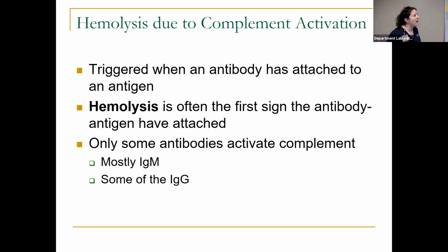And keep in mind too that hemolysis is considered a positive reaction in blood bank. I think I've mentioned that before, especially if you are doing your testing and after you centrifuge and you're grading your agglutination and you notice a very small cell button and a red tinge to your test tube, coloration of your supernatant, that indicates hemolysis. That is a positive reaction, okay?